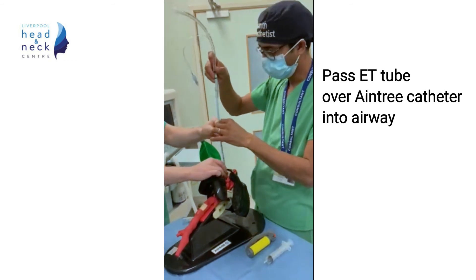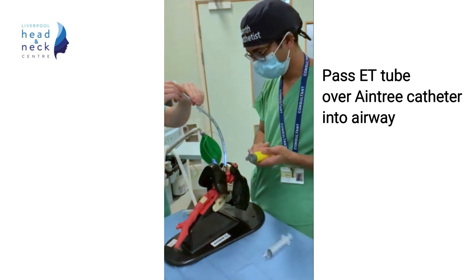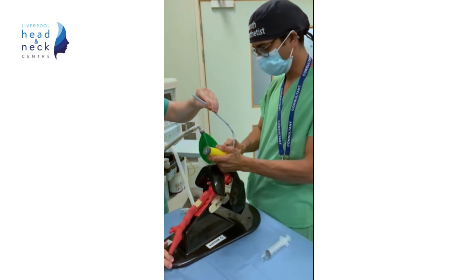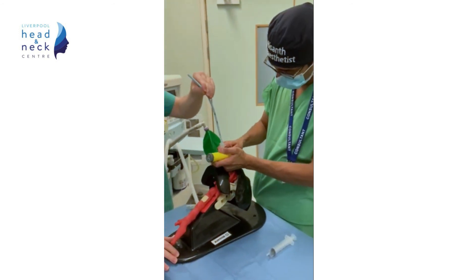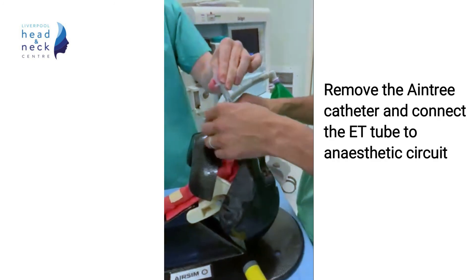We then pass our endotracheal tube over the Aintree using a laryngoscope to assist tube delivery. We then connect to our anaesthetic circuit.